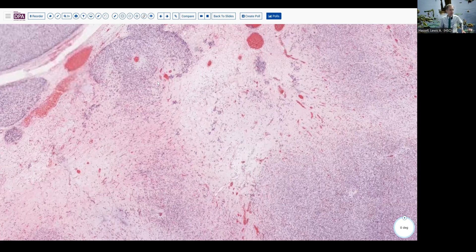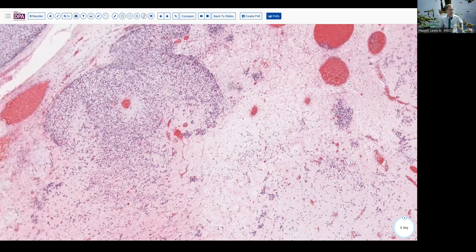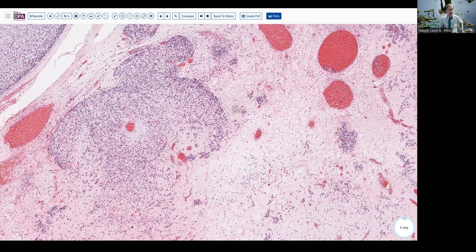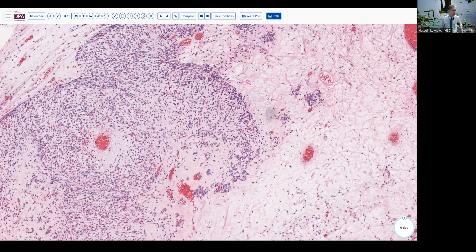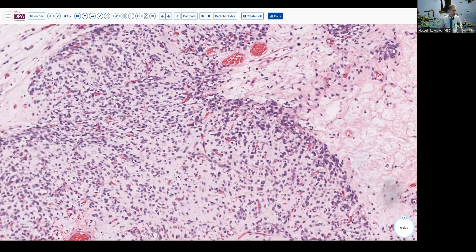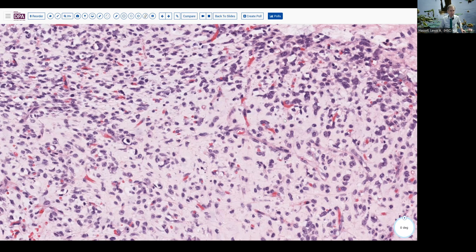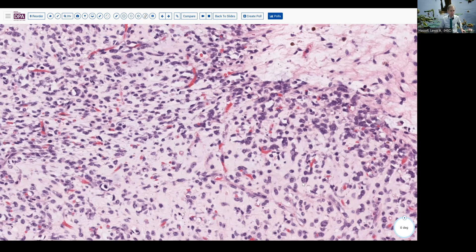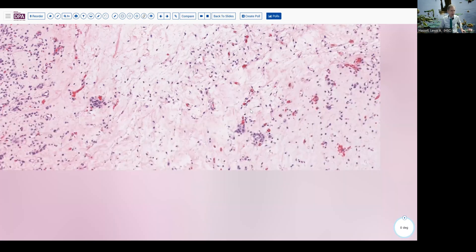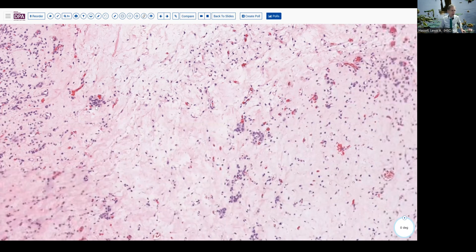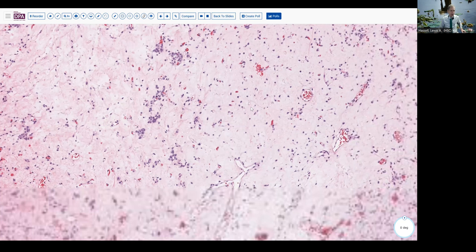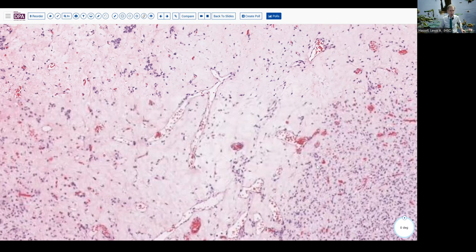Many myxoid lesions have a sort of nodular pattern. Myxoid chondrosarcoma can have that appearance, as can myxoid liposarcoma. Low-grade fibromyxoid sarcoma is typically described as somewhat nodular, although we certainly don't see any fibrous component in this tumor. And looking at these cells, we see there is a background of delicate vasculature here in several areas — a few larger vessels, but mostly very small, delicate capillary-sized vessels and these round, fairly uniform cells. Again, you see just very sparse blood vessels, and usually in intramuscular myxoma you certainly would not see this kind of vasculature.